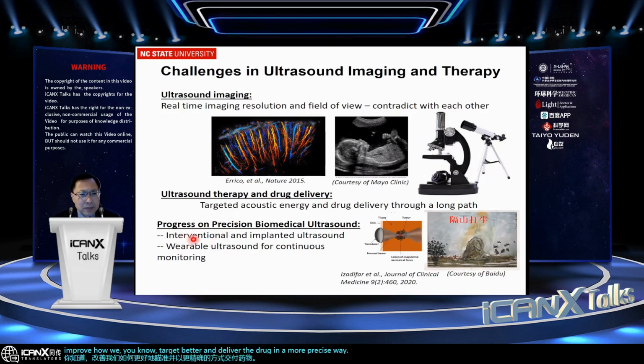So what I will report today is more about progress on precision biomedical ultrasound, trying to solve some of the ultrasound imaging, therapy, and drug delivery challenges by looking at interventional and implanted ultrasound, and wearable ultrasound for continuous monitoring.